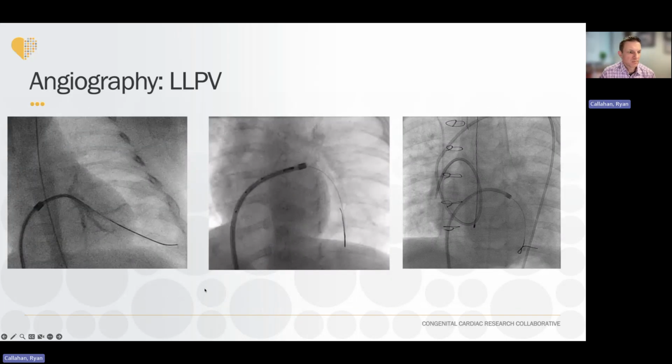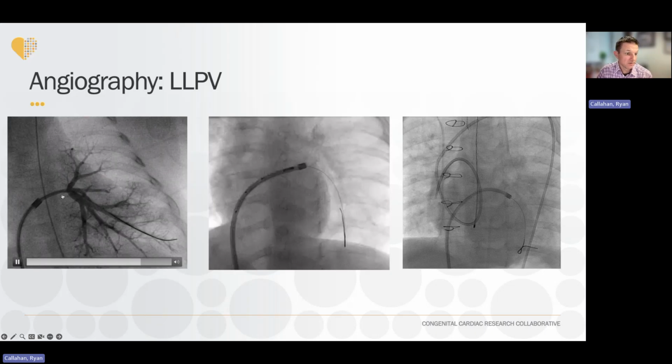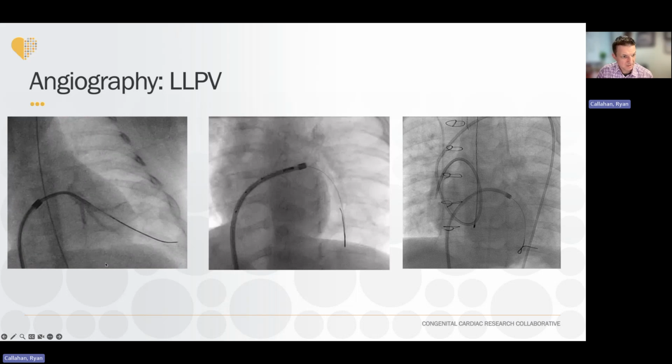And then we have a bunch more examples. We're actually injecting into the vein, as I mentioned, when the stenosis is severe and the catheter nearly blocks the flow. In this case, it completely occludes the flow. Then it would opacify the whole pulmonary vein, and that's severe.